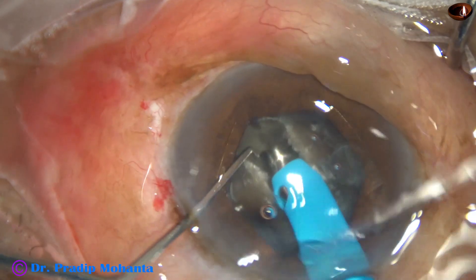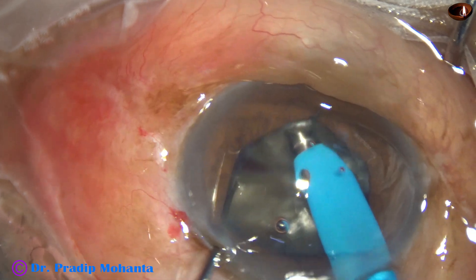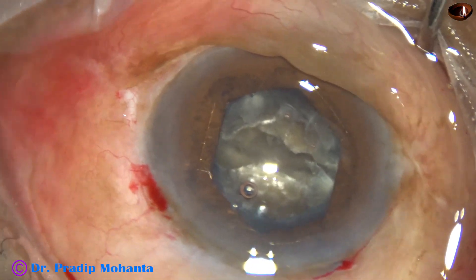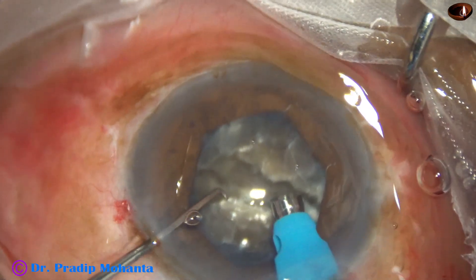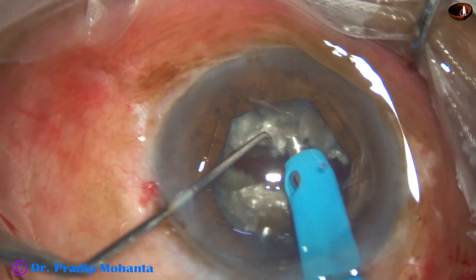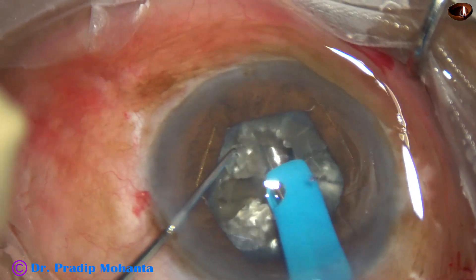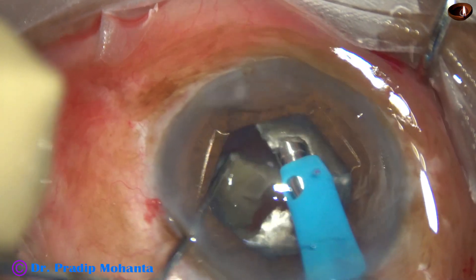The nucleus is rotated 180 degrees. One hemi-nucleus is held with vacuum and the chopper is used to divide the nucleus into two hemi-nuclei. Visco is injected again to protect the corneal endothelium. Now one hemi-nucleus is to be divided into two parts. I go through the substance and occlude the tip nicely. The tip was not getting occluded at first, but here I get a nice occlusion and I divide the nucleus.